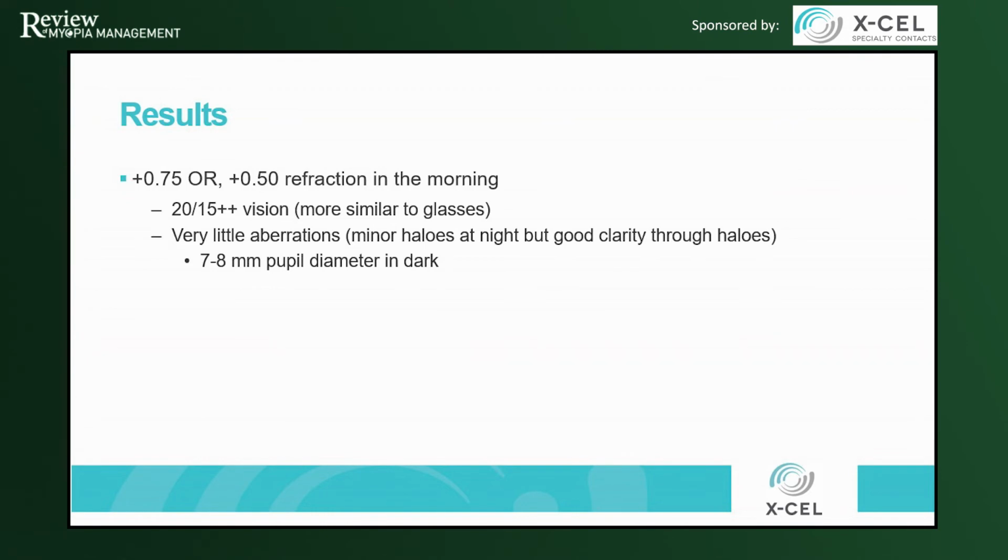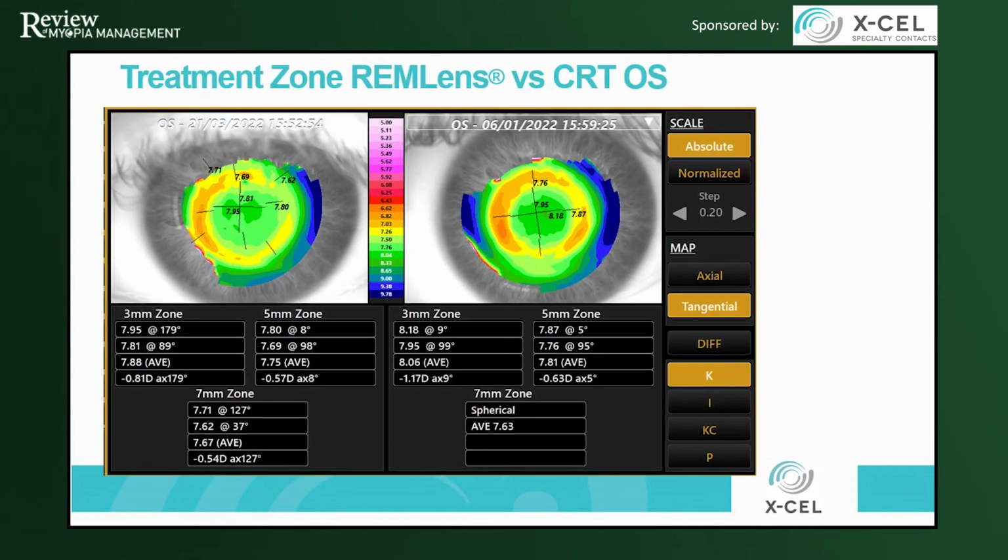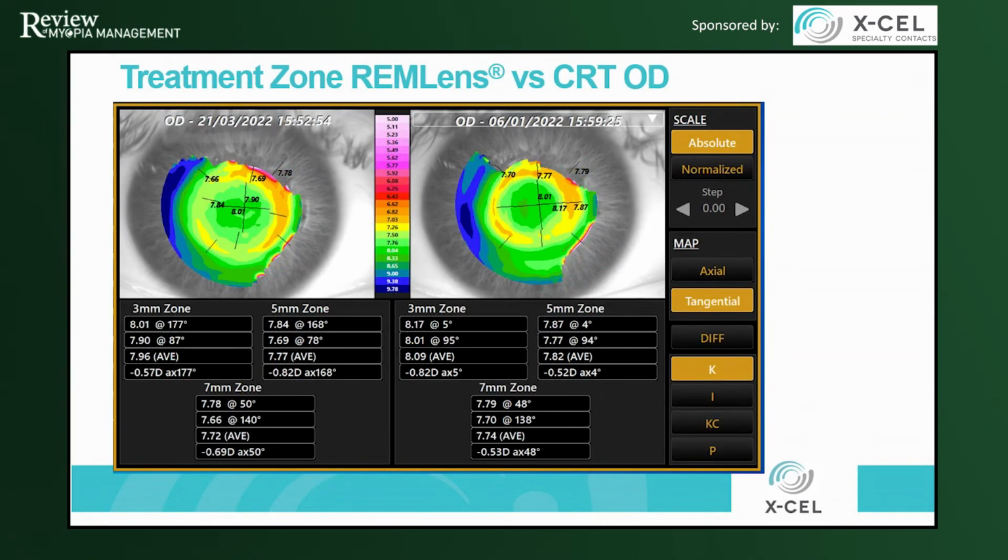So in the final two topographies that we have here, the topography on the left is the REM lens, and the topography on the right is the lens that I started in. And that treatment zone is appreciably bigger in the REM lens than it is in the other design, starting with my left eye and then going over to the right. And you can see that it's a little bit bigger.